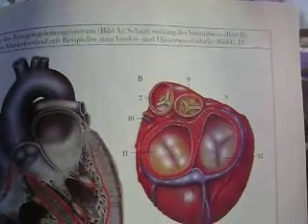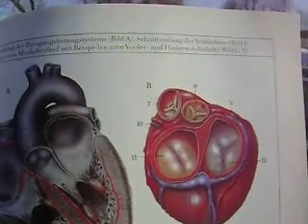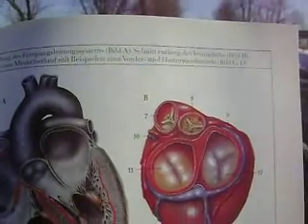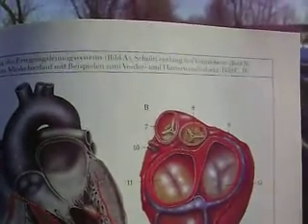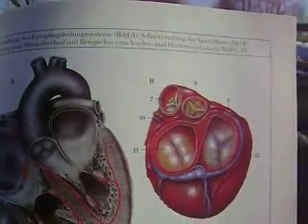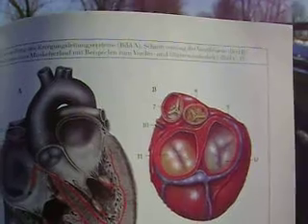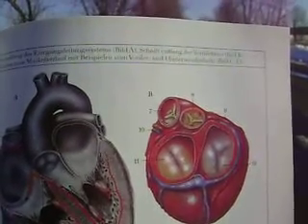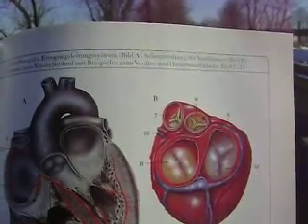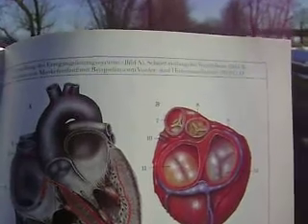You'll see a small opening above the aortic valve, and that is the entrance to the right coronary artery. On the other side is an entrance to the left coronary artery. At that point, the cardiologist is able to introduce a catheter into the orifice of those arteries and inject a small amount of contrast dye.